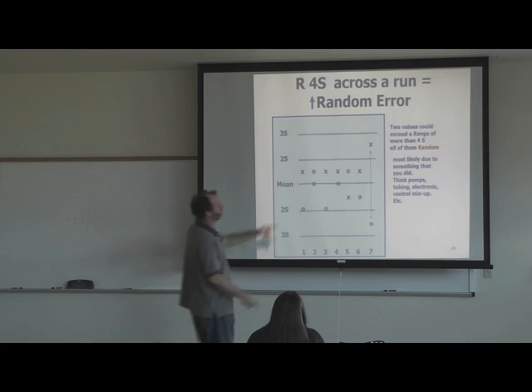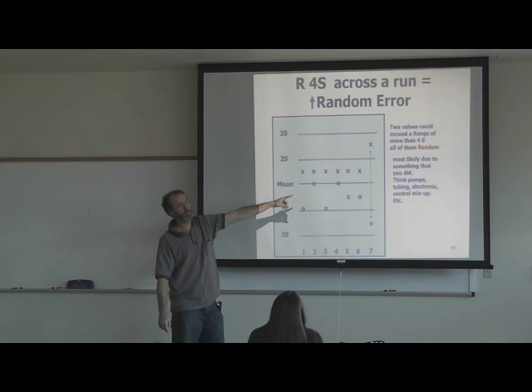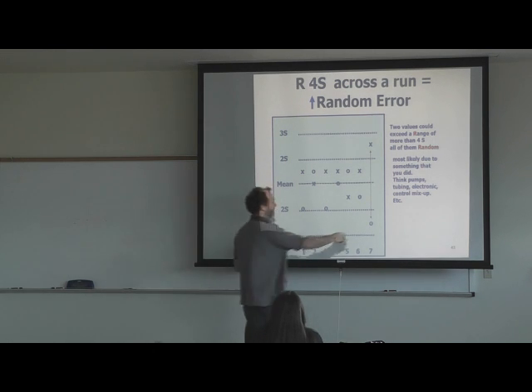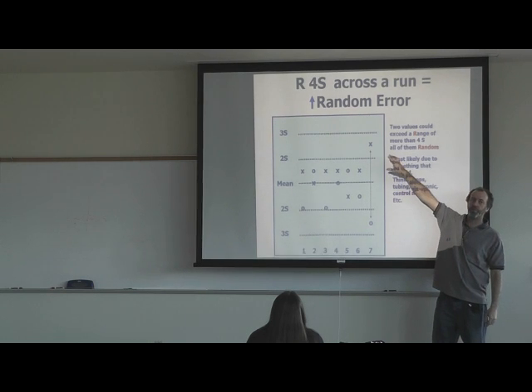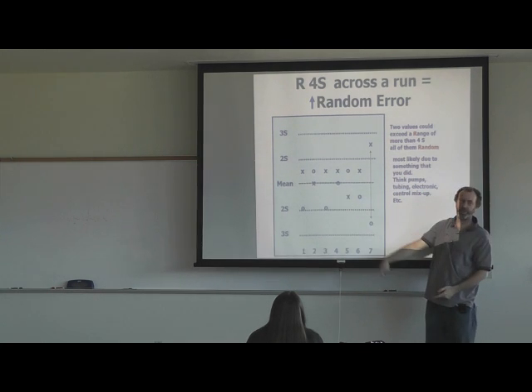If you have both are 2, a lot of people, when I put an example like this on the test and you got to name which Westgard rule it violates, they'll put 2S because you have 2 samples in 1 run that are greater than 2 standard deviations away from the mean. But what this rule violation really is, is an R4S because they're 4 standard deviations apart.